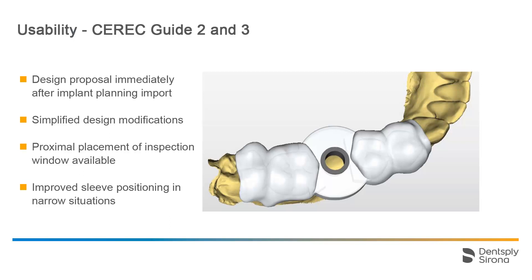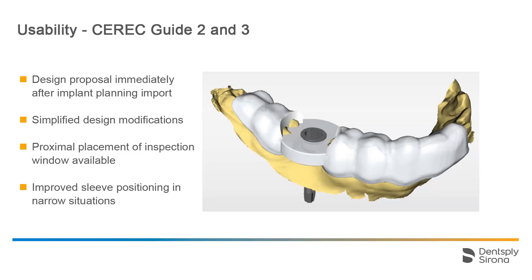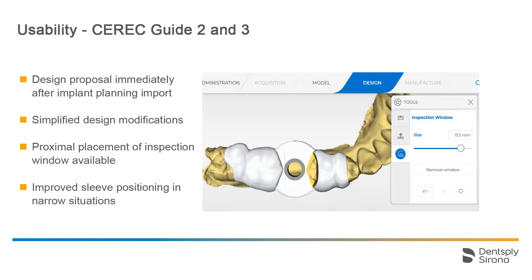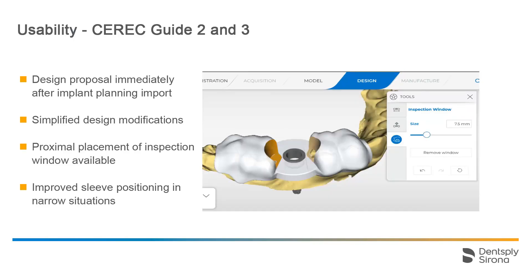The guide can further be modified with the new tools. It is also possible now to place the inspection window proximal to the sleeve or implant position. This offers the additional advantage of improved sleeve positioning in narrow situations. For detailed information regarding these functions, see our tutorial Design Workflow CEREC Guide 2 and 3.